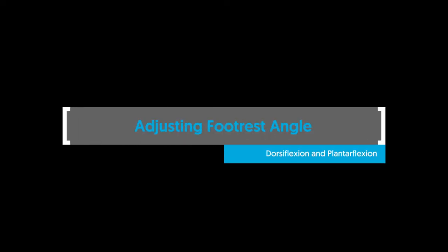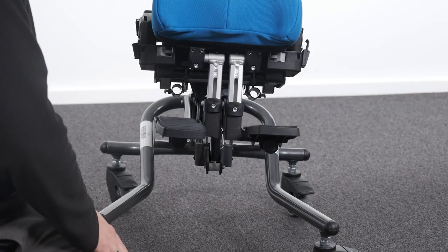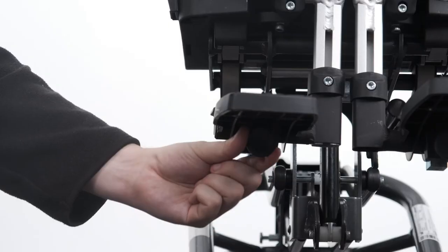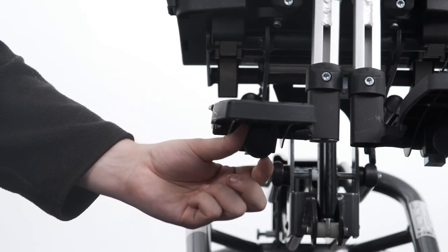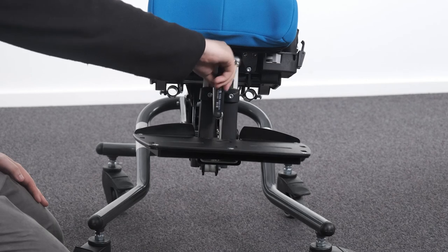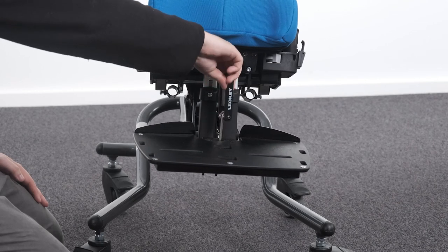Adjusting footrest angle — dorsiflexion and plantarflexion. To adjust the angle of the footrests to accommodate dorsiflexion and plantarflexion on the two-piece footplate, loosen or tighten the hand knob underneath the footplate to the desired position. To adjust the angle of the footrests to accommodate dorsiflexion and plantarflexion on the one-piece footplate, loosen or tighten the bolt on the top surface of the footplate to the desired position.